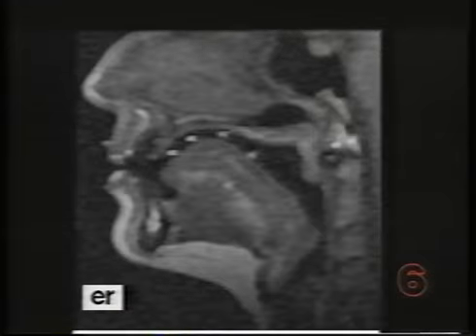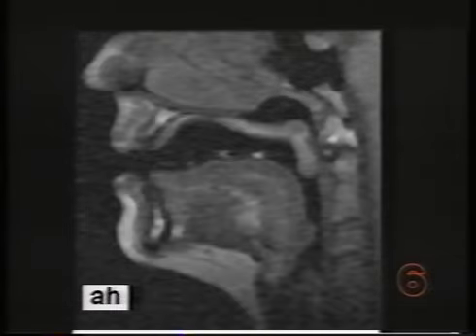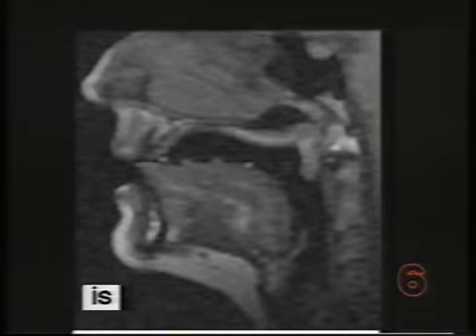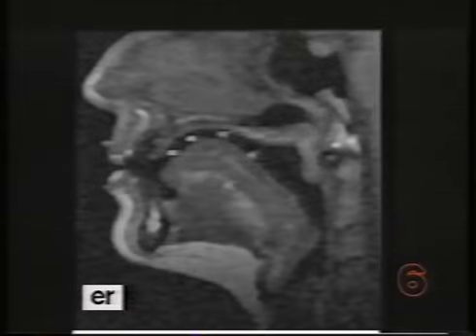In subsequent work, study of the posture of the tongue during articulatory gestures employed the use of pseudopellets secured to the subject's tongue. Images acquired with the pellets in place allowed the investigation of correspondence between movements measured using other technologies and those obtained using MRI. This information is valuable because it defines placement of markers used in dynamic technologies such as magnetometer and X-ray microbeam experiments. It also is vital to testing the computational modeling in which articulatory movements in the vocal tract are used to generate changing area functions.